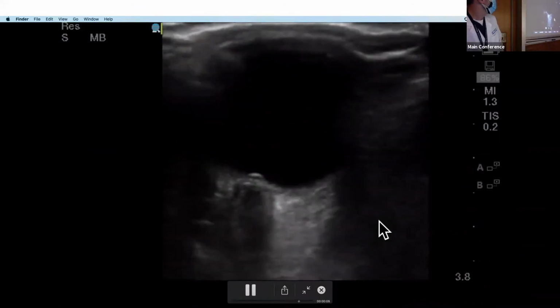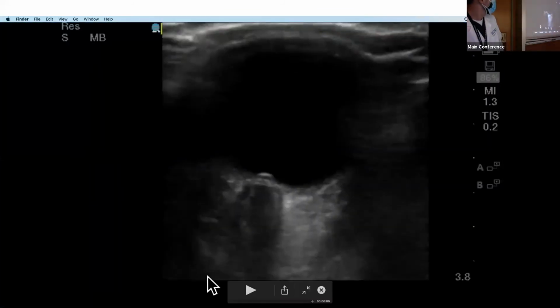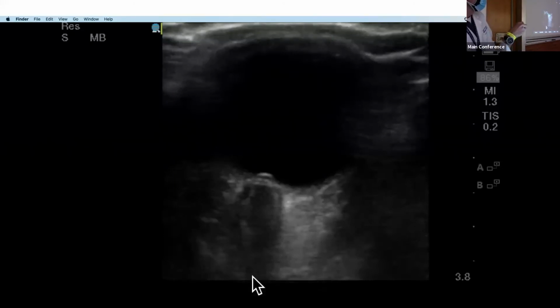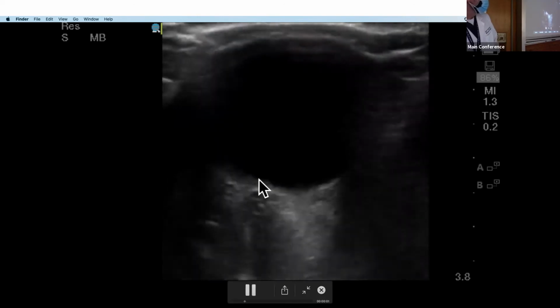Nothing else really focal on neurological exam, but they had us come down to look at her eyes, and we definitely saw this. After that wonderful lecture, I hope you'll appreciate that there's something atypical in this posterior chamber. We see a bulge there, and with any sort of bulge we have to answer why. It's a hint of papilledema.